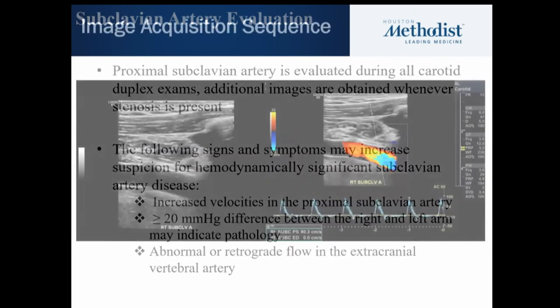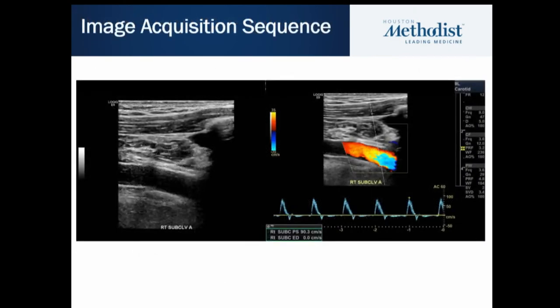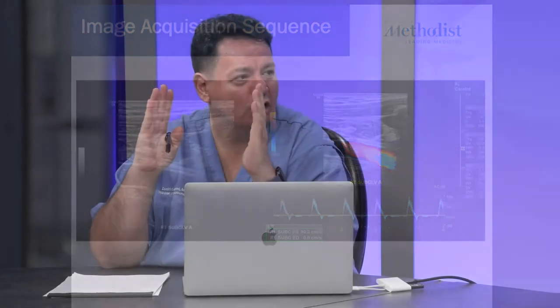There's one more: the flow volume. This is one more thing we implemented. I think we stole it from Dr. Peden's AVF protocol. We came up with this idea that if you have significant carotid disease, the common carotid artery gives you the circulation to the whole head, the whole 100%: 40-40 by the two carotids, 10-10% by the two vertebrals.